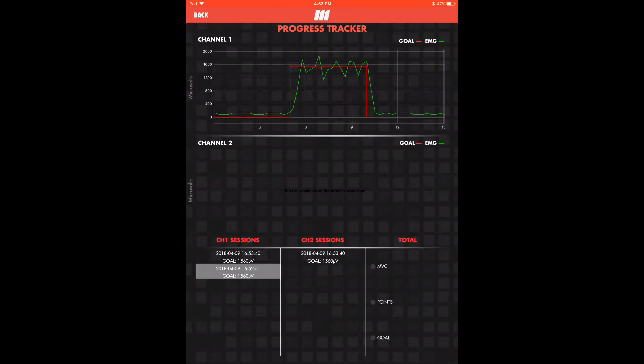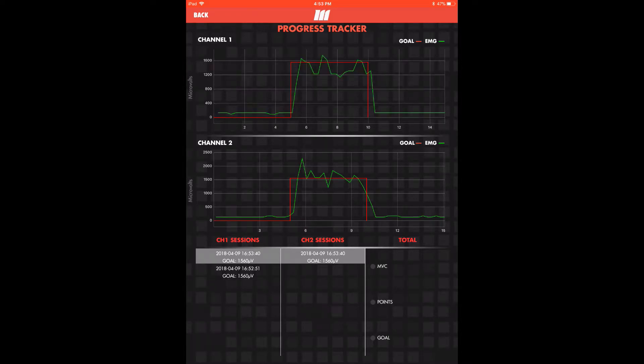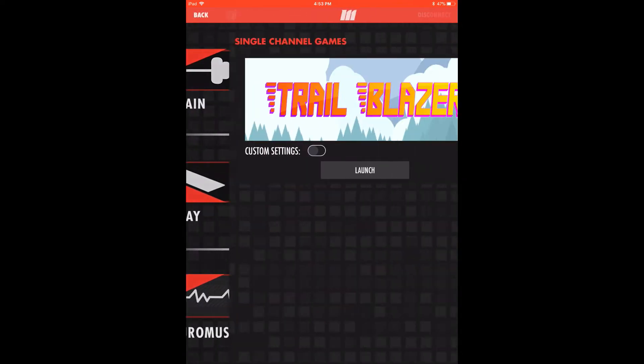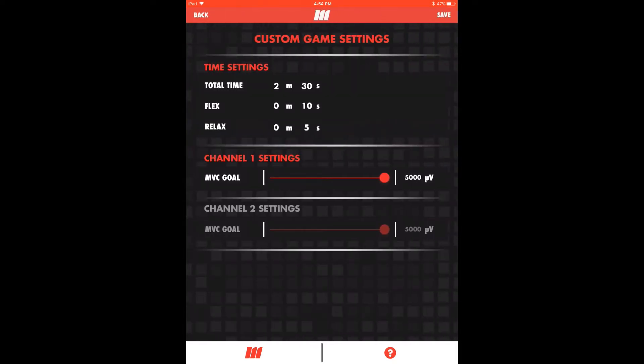Select sessions with the same timestamp to see output from both channels at once. We'll now explore the gamification of biofeedback by entering the play module. Settings will automatically match those for train, which have already been saved. To customize settings for a single round of play, toggle the custom settings switch and tap the gear icon to make adjustments. Here we can lower or increase our goal to change the difficulty of the game, as well as change runtime.